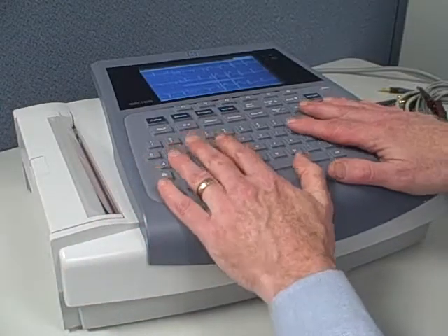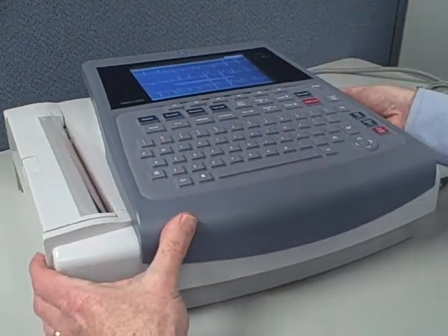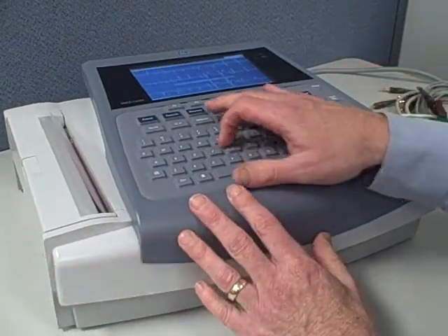Hi, this is Walt and today we're looking at the GE MAC 1600 EKG machine, a new offering in the mid-range of the GE line.